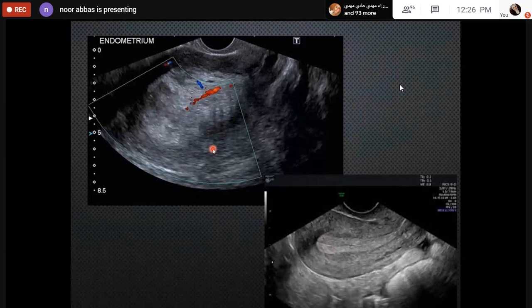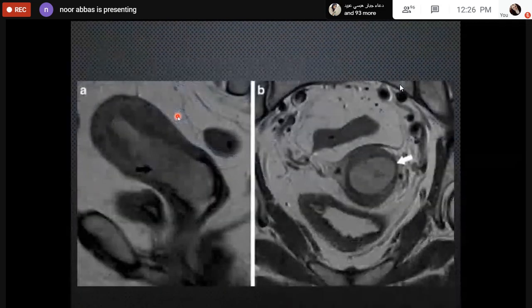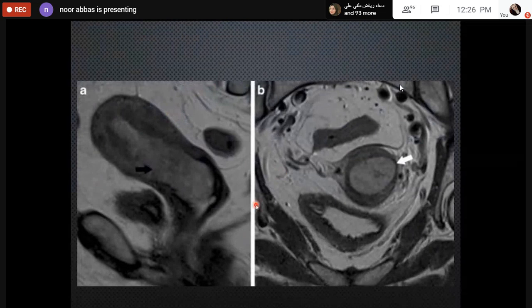Okay, لكن MRI مثلاً تلاحظون this is extensive thickening of the endometrium, ممكن يكون hyperplasia, ممكن يكون polyp, ممكن يكون cancer, راح أدزها على biopsy, biopsy بعدها ترجع للpatient endometrial carcinoma, now go and do MRI, not CT. كل شيء CT ما قال لكم he did not suggest CT for endometrial pathology because it is useless لكن MRI راح يكون obvious وراح يشوفنا ال invasion into the myometrium.